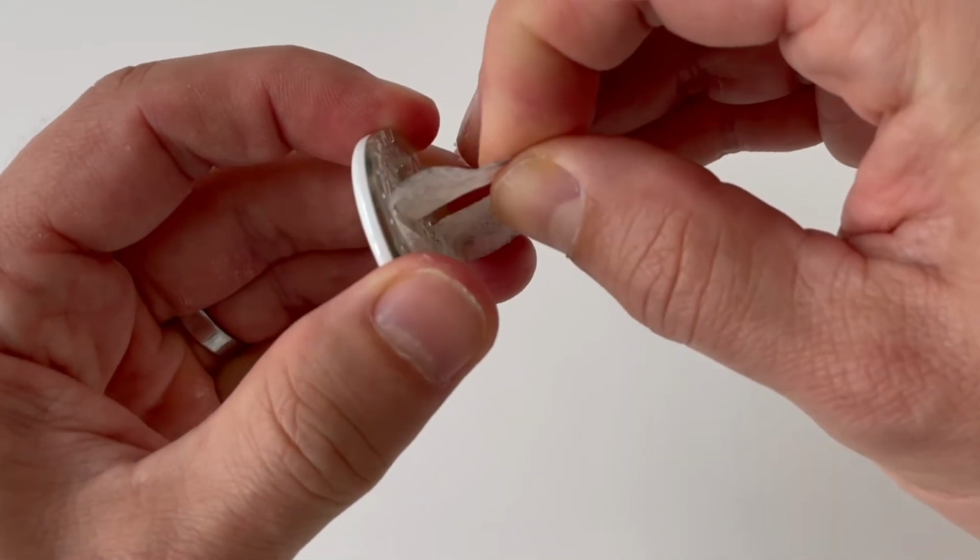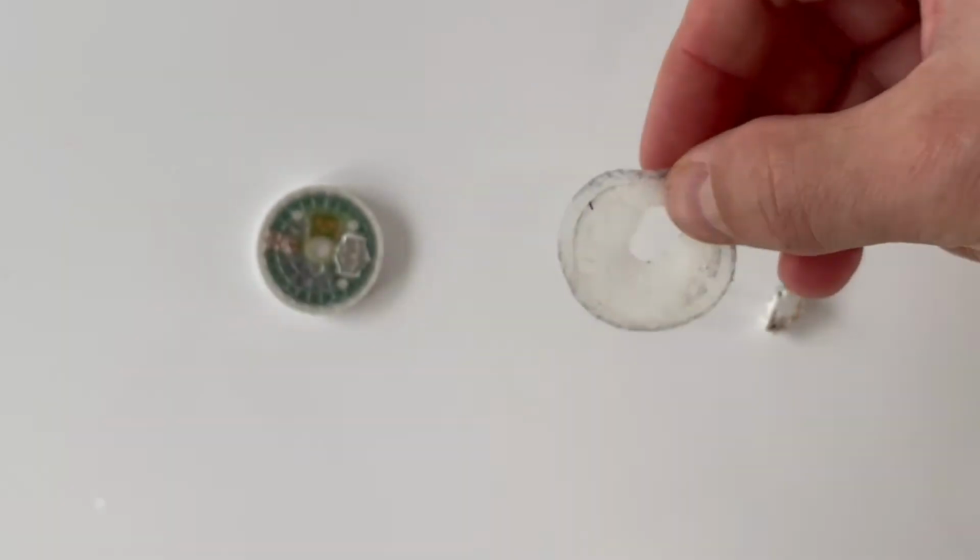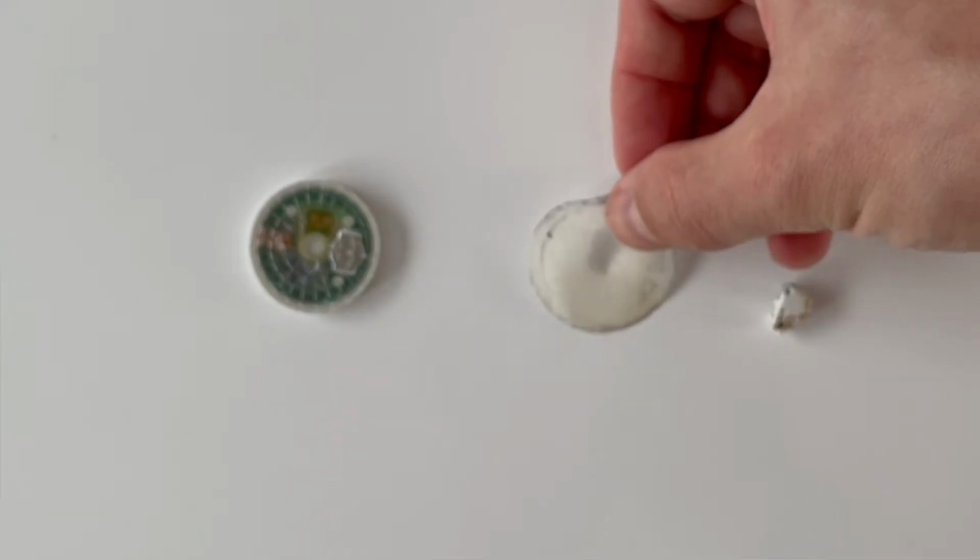The adhesive I just throw in the trash, and because there is a battery inside the sensor, I place the whole sensor into the battery disposal bin. So this was the first DIY option. The second option how to recycle the whole sensor kit is Abbott's Sensor Kit Take Back pilot program, which was announced just a few weeks ago.